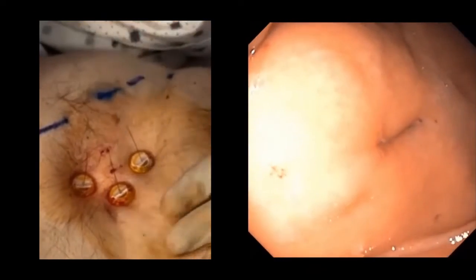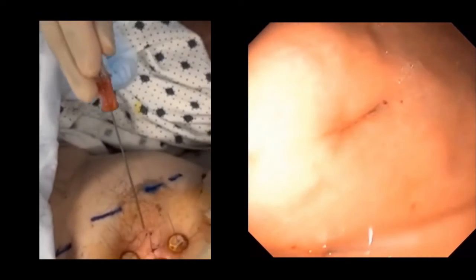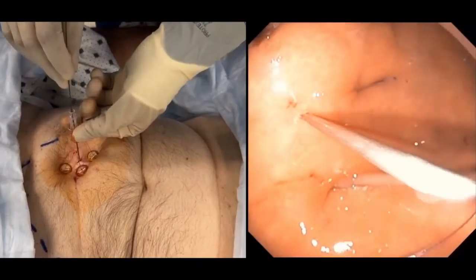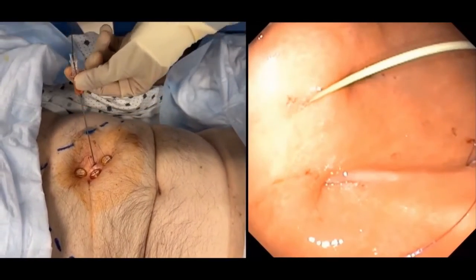Now we make a one centimeter skin incision at the tube insertion site and insert the guide wire introducing needle into that incision. As we confirm seeing the guide wire inside the stomach with the endoscope, we remove the needle and keep the guide wire connecting the stomach with the outer surface.